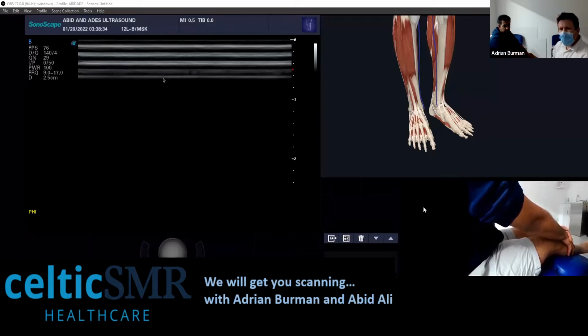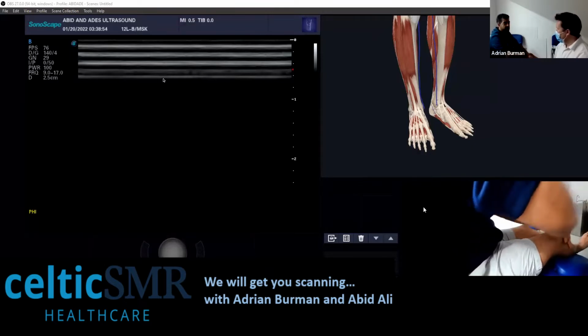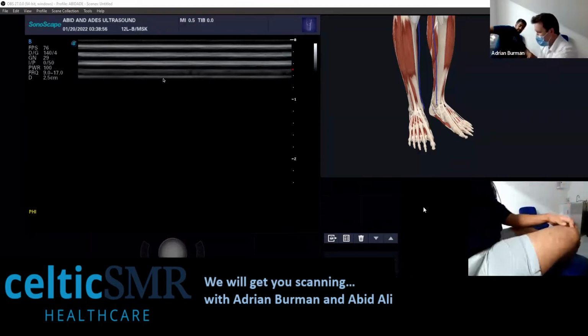So I think the first module that was done was the elbow. So I think Adrian's happy to just start scanning and going over it. Hopefully that gets us all warmed up and questions start coming in and we start flowing. Otherwise, we'll just carry on looking maybe at the shoulder next and then the knee and see how we go. So over to you, Adrian. Would you like my elbow? Yeah, we can do that.